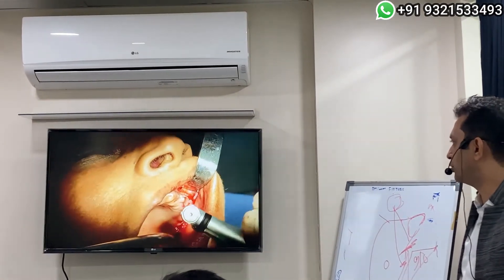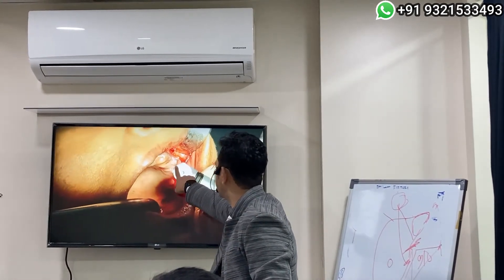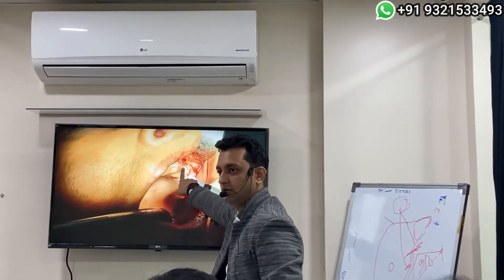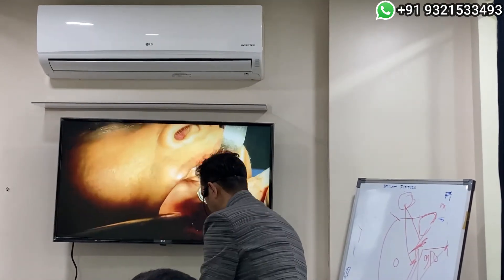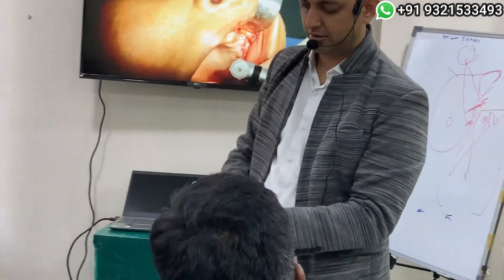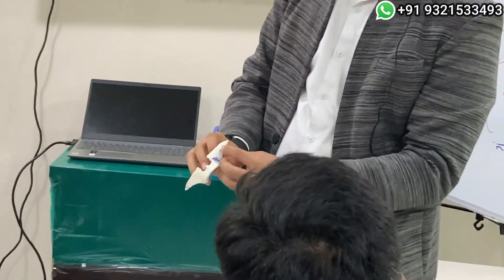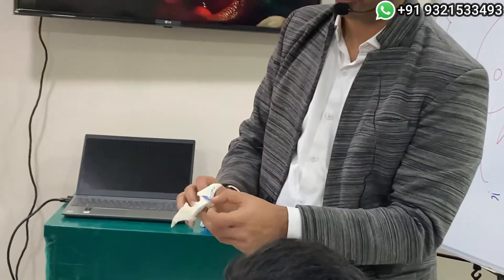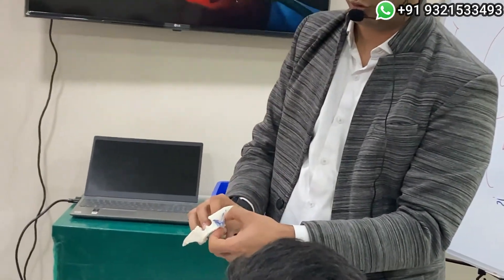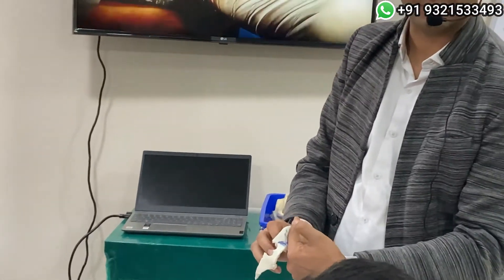You can appreciate the new point and the old point — the old point is here, and the new point is next to it. On the zygomatic bone, my old point was somewhere here. Now you can understand — when I do it like this, I'm going laterally, whereas earlier I was going like this.